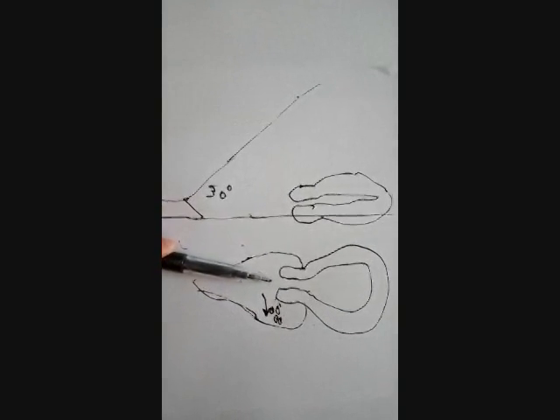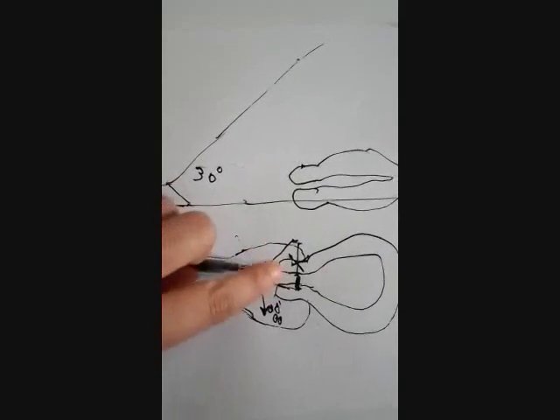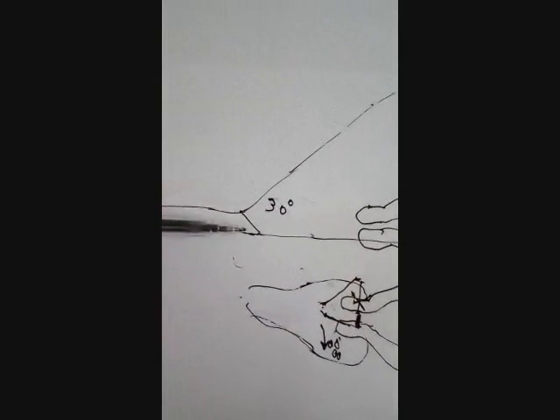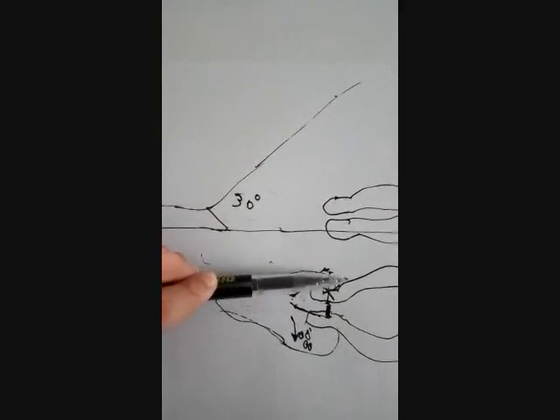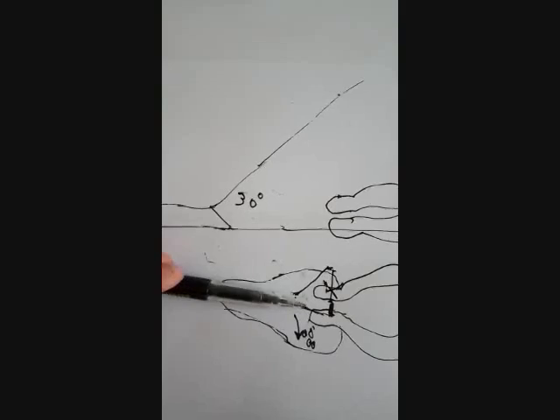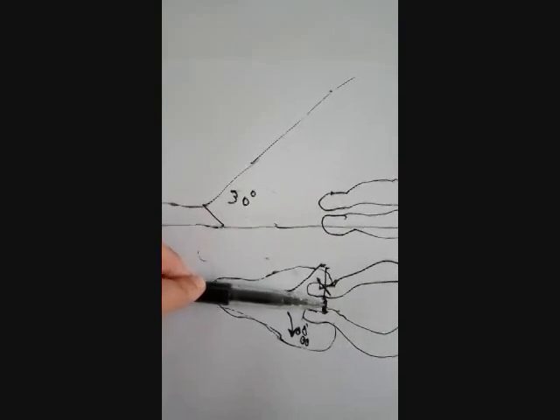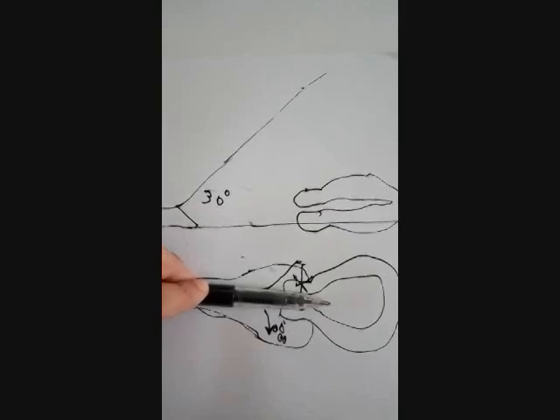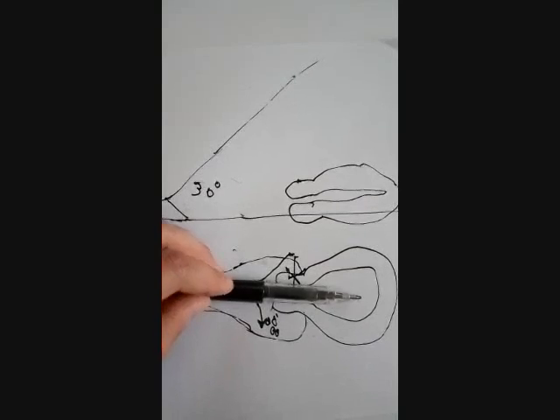And then we put the cervix at 6, down in the picture, not in the upper part of the picture, and not in the center of the picture. We put it at 6. Once it is at 6, we can advance the tip of the scope very slowly. We will penetrate the cervix. We get into the uterine cavity. And we go slowly, like millimeter per millimeter.